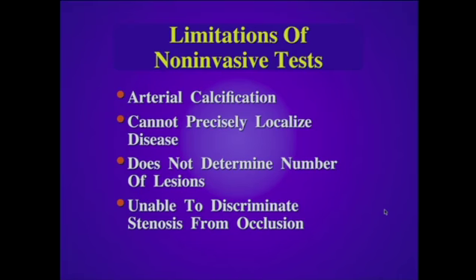One must recognize that there are limitations of the non-invasive tests. Underlying arterial calcification can preclude adequate pressure measurements, as these vessels can be non-compressible. These tests are also limited in that they cannot precisely localize the disease, nor can they determine the number of underlying lesions. The indirect tests also are unable to discriminate a significant stenosis from occlusion.